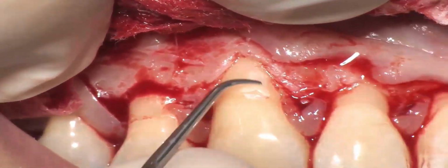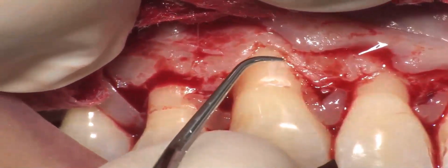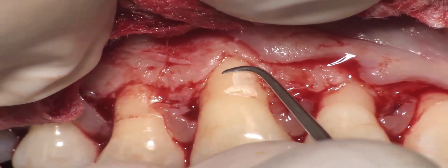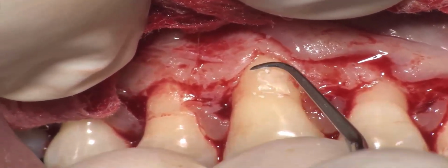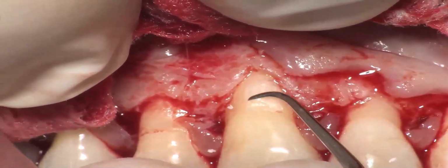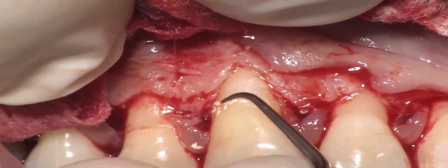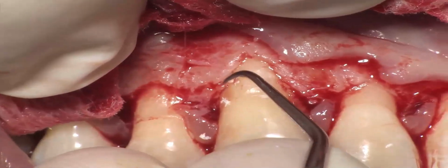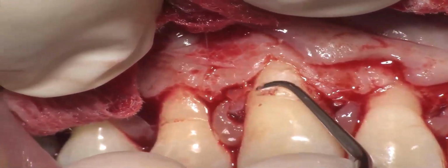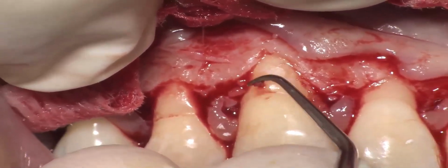The last millimeter of the root exposure close to the bone is not grinded because it was not probable before the surgery, and we still have some healthy root cementum with connective tissue fibers still inserted.